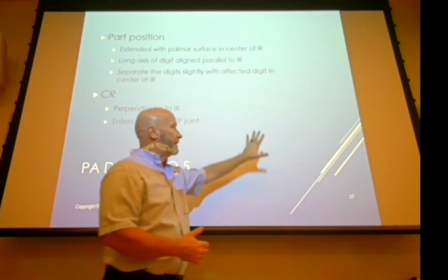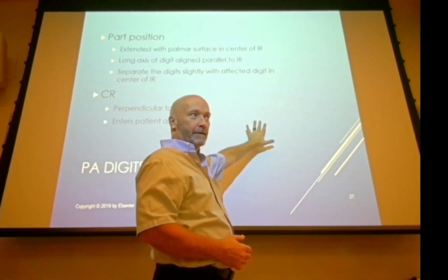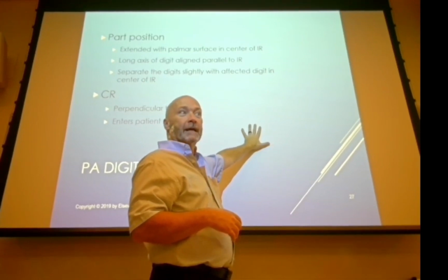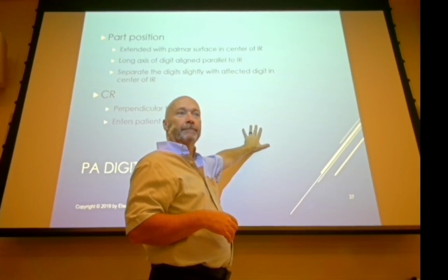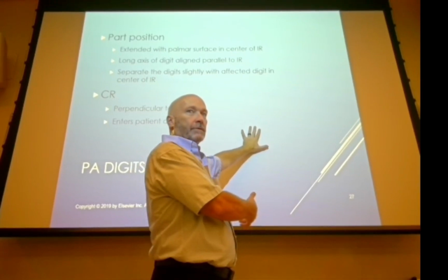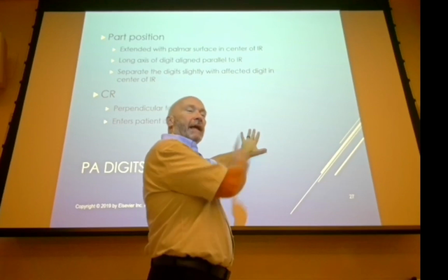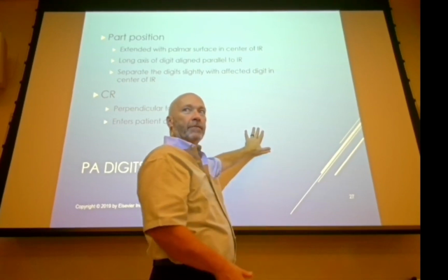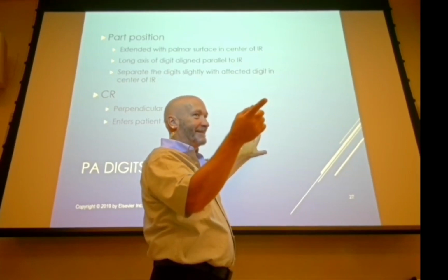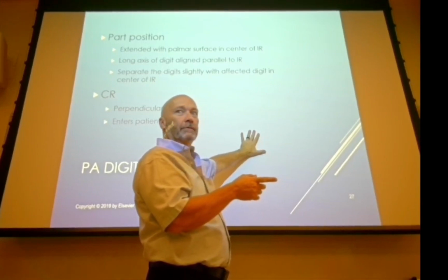Number two is that if I put my hand flat like that, what position is my thumb in? Not projection. It's kind of oblique, right? It's not really lateral. It's certainly not prone. It's kind of oblique. So what position is your hand in to get a good oblique of the thumb? We're back to, he did it again. Prone. Back to prone, right?